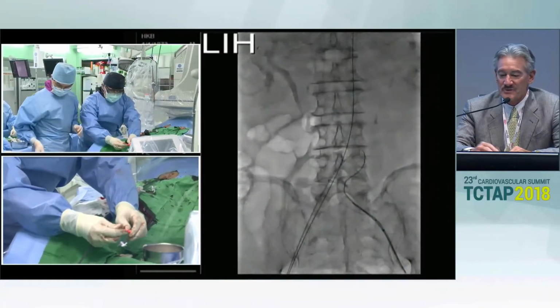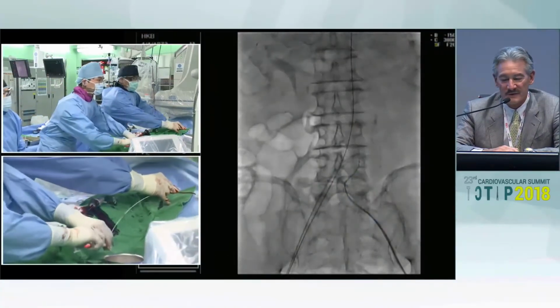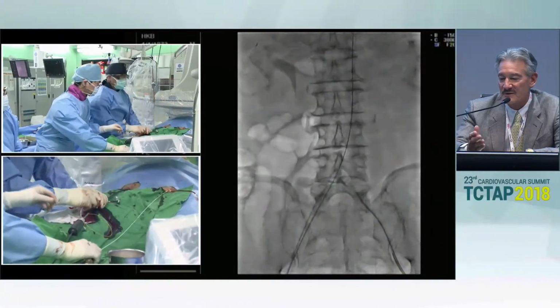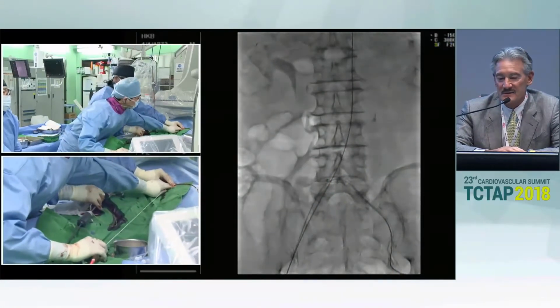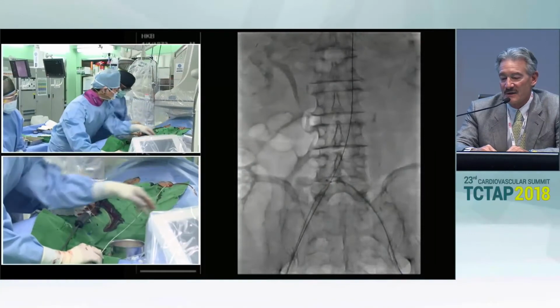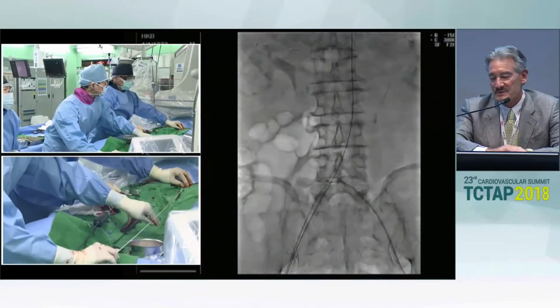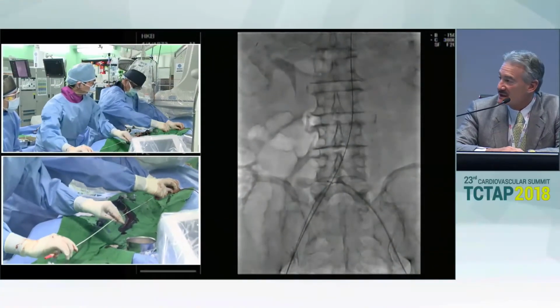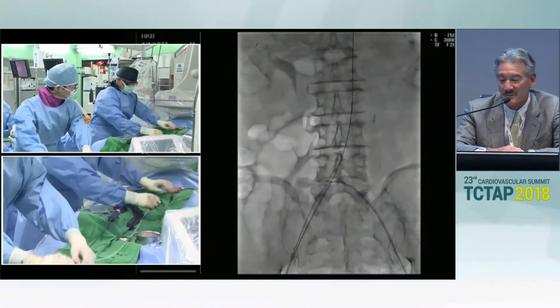Now you can pick and choose which device you want to apply. I think this device should perform perfectly well in this scenario, but there's a variety of devices you could choose because your neck is long. You have a 40+ millimeter long neck, so I think it's dealer's choice as far as which graft to apply. This one appears to be perfectly fine as far as being indicated for this case. So I see this as well indicated and a decent choice of device to apply.